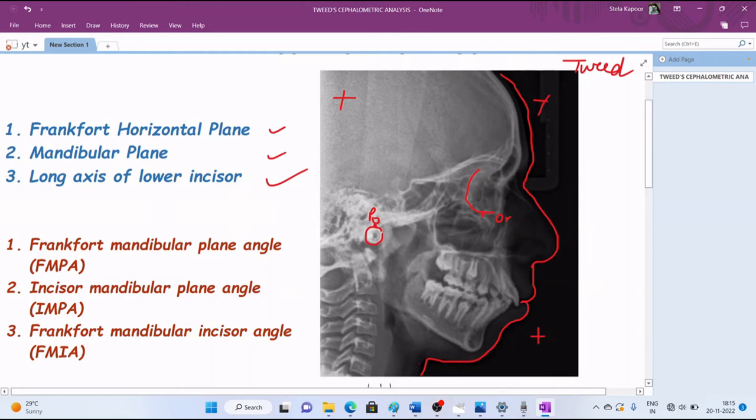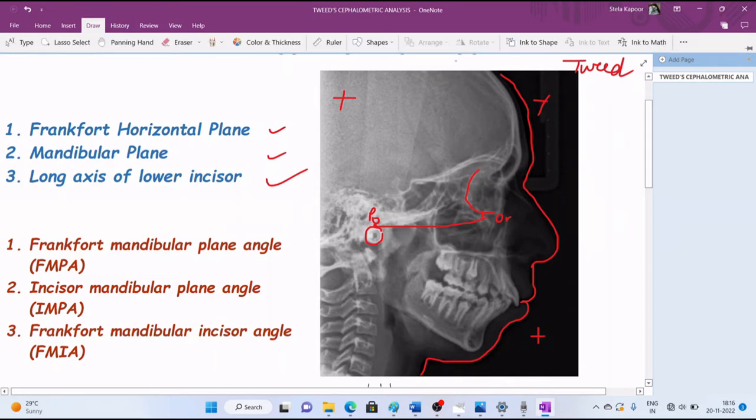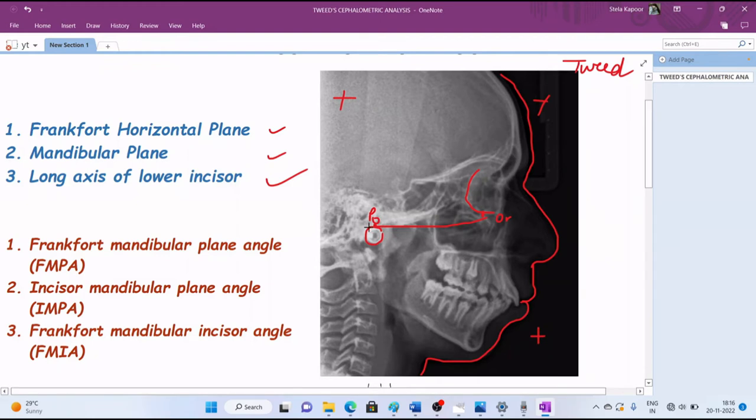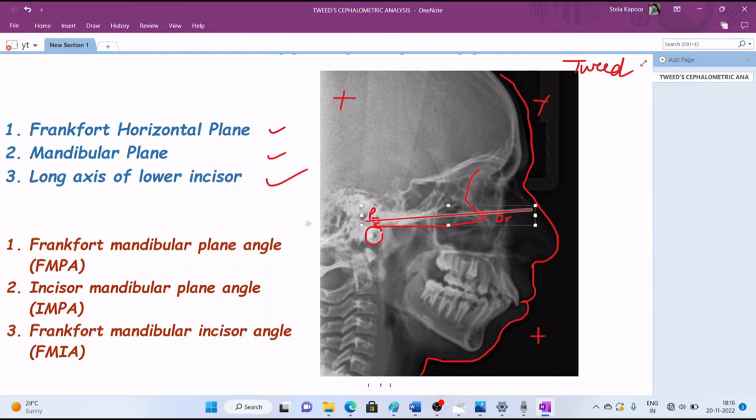As I mentioned previously, we have three planes. First is the Frankfurt horizontal plane. This plane is formed by joining the lines porion and orbitale. This is our FH plane from porion to orbitale.